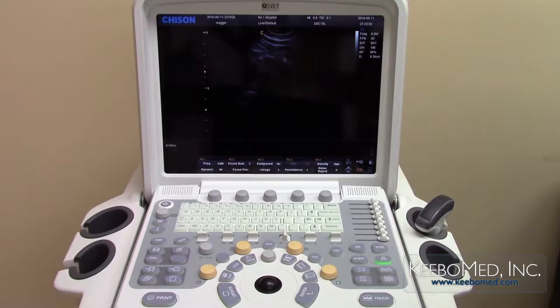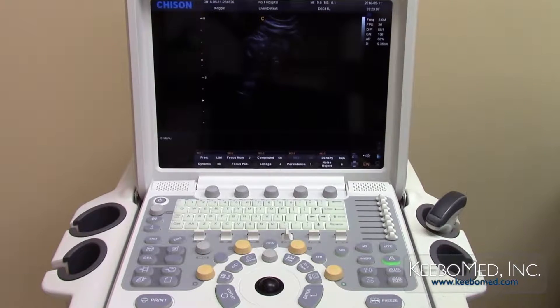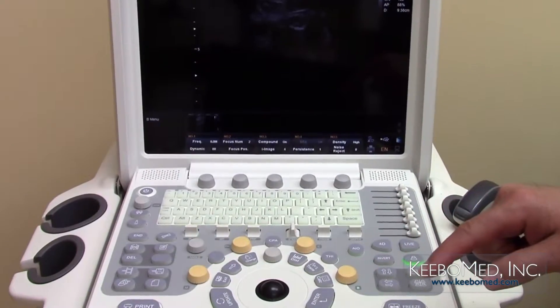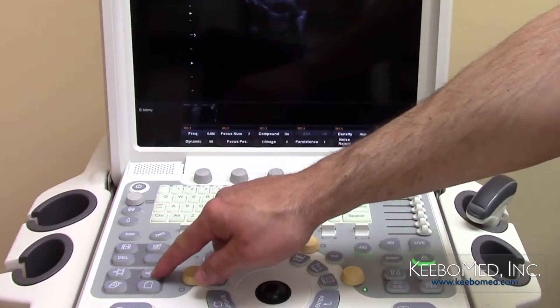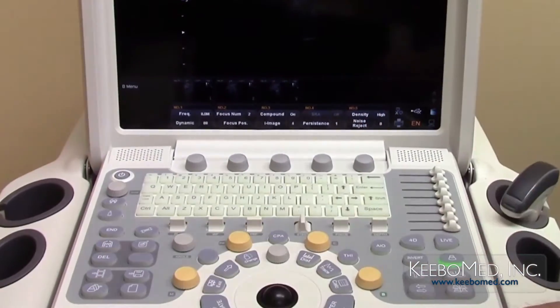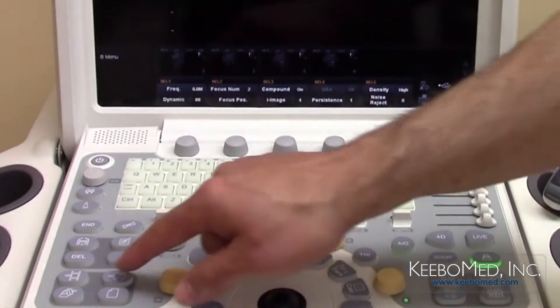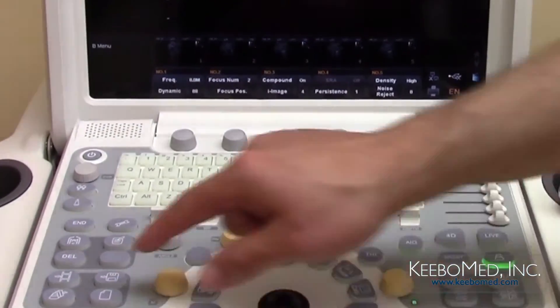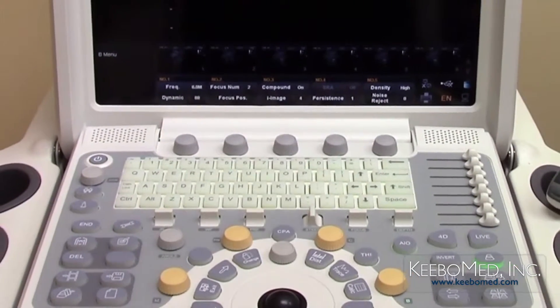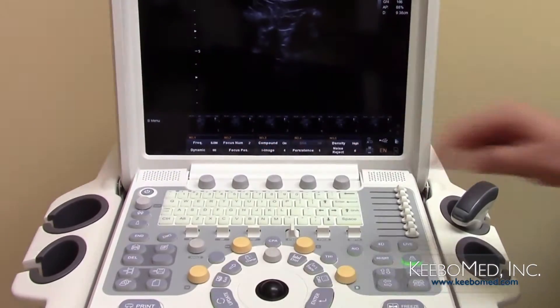After a good image is achieved, it can be easily saved by pressing the image save button on the left of the keyboard. Images can be saved during real-time exams, and the saved images will appear on the bottom of the screen. To the left of the image save button is the cine loop save button to save a cine loop.